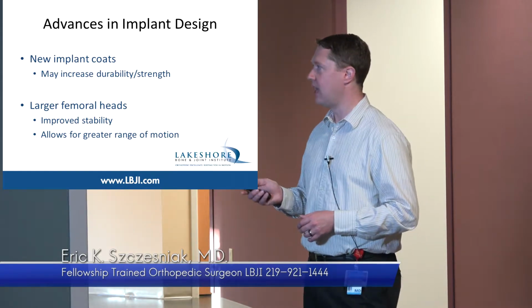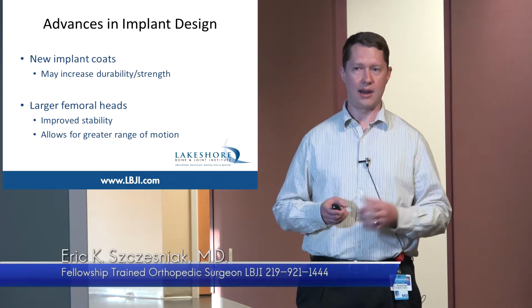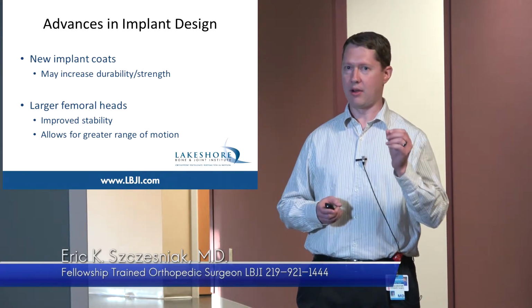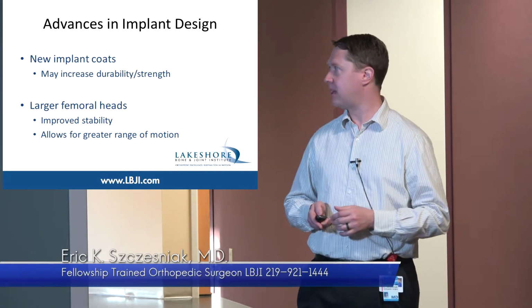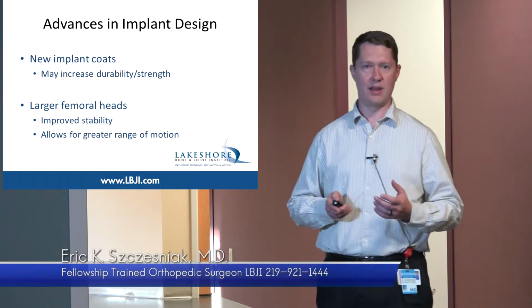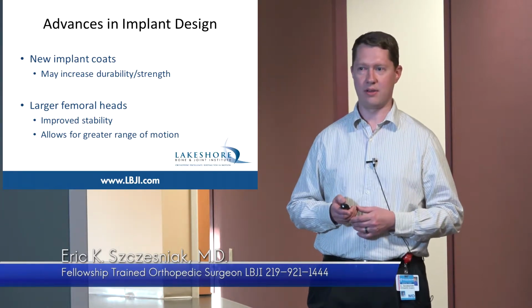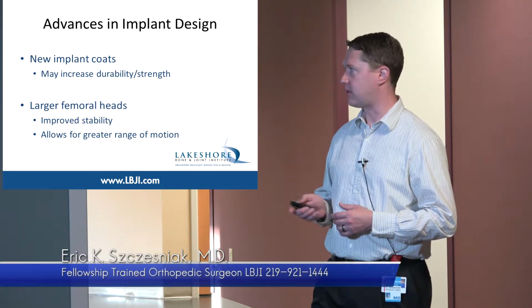The other thing we've done is we've used larger balls in the ball and socket. As the materials have gotten a little bit better, we can make them thinner so they take up less space, which makes more room for a ball. And the big thing that does is it increases the stability of the hip. I mentioned that replaced hips have a little bit of a higher risk of dislocation, but by using these larger heads, that decreases dramatically.